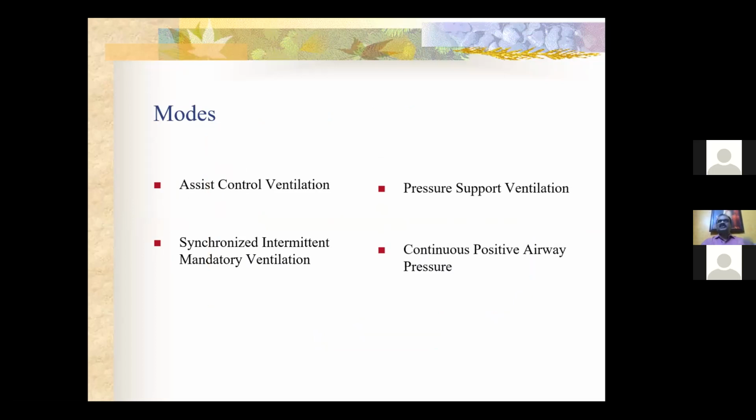That too is not favored now, and usually SIMV is now used in post-operative cases only. I don't use that in my ICU, and many intensivists don't use it.